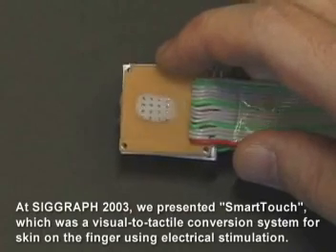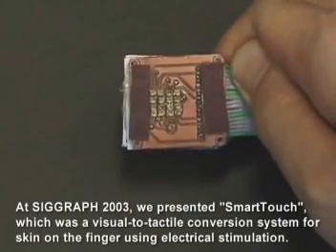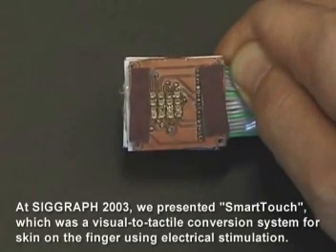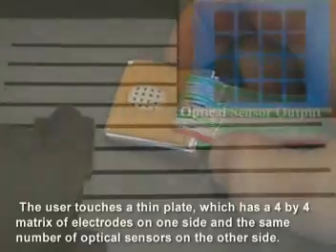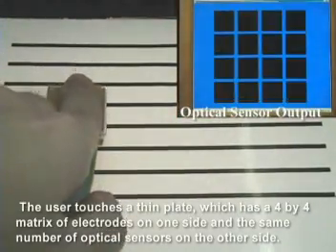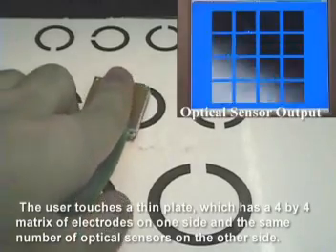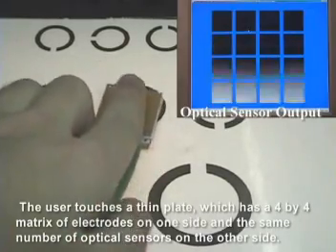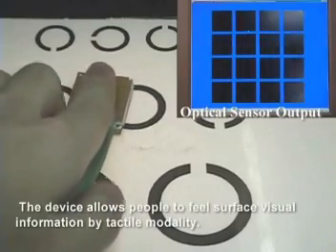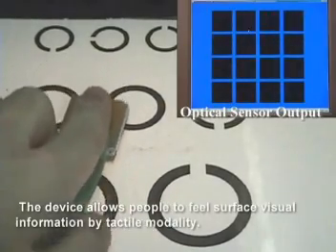At SIGGRAPH 2003, we presented SmartTouch, which was a visual to tactile conversion system for skin on the finger using electrical stimulation. The user touches a thin plate, which has a 4x4 matrix of electrodes on one side and the same number of optical sensors on the other side. The device allows people to feel surface visual information by tactile modality.